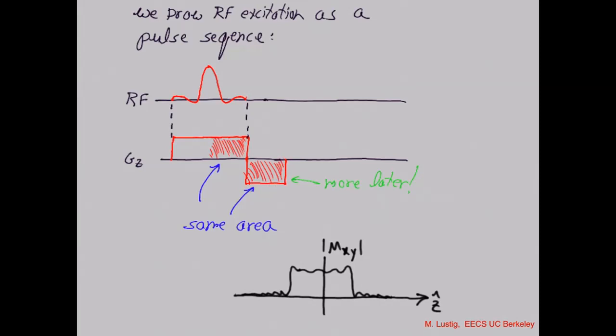While the gradient is positive, turn on the RF and trace a modulated sinc RF pulse. That's what the scanner hardware is going to do. It's going to feed RF into the RF coil, a constant current into the gradient coil, and then a negative current into the gradient coil. Does that make sense?